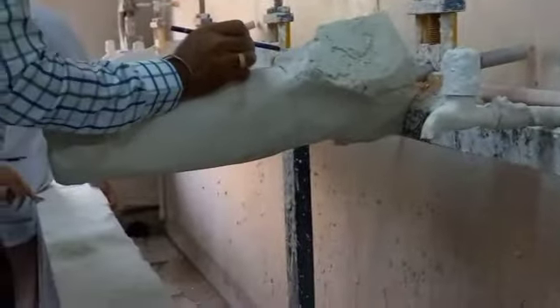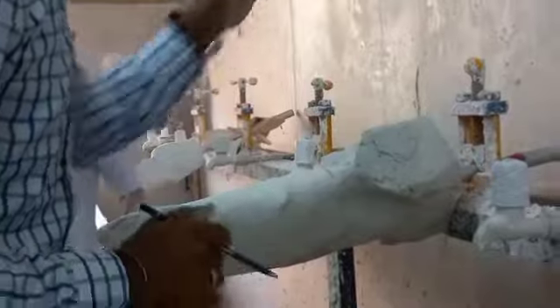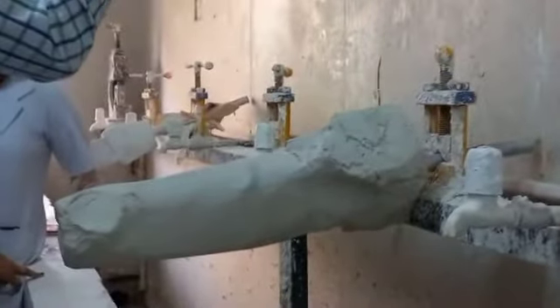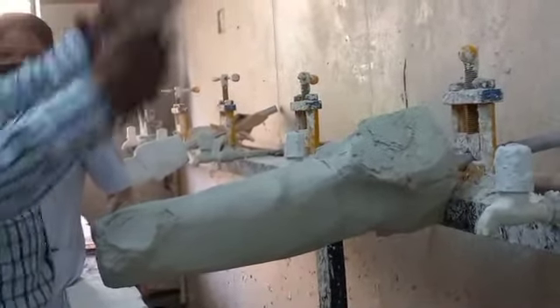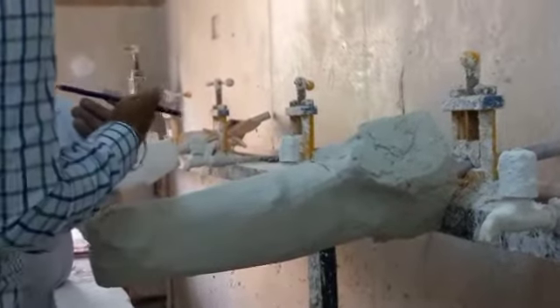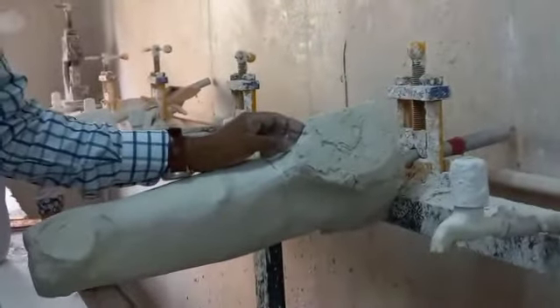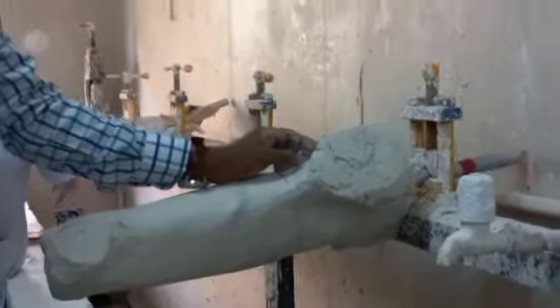It depends so much upon how much you are really catching, right? Your hand trajectory is going from posterior, the person is going as high as possible. So how much is he able to catch the ramus, right? Normally if it is 2 centimeter, then also it's containing. But if you have a flexible brim, right? Our plastic is not a flexible brim. It's a rigid brim.